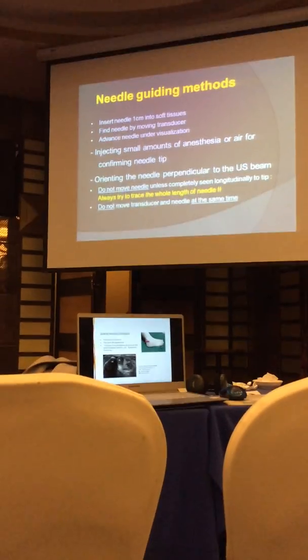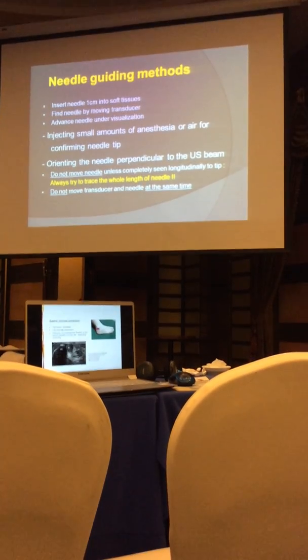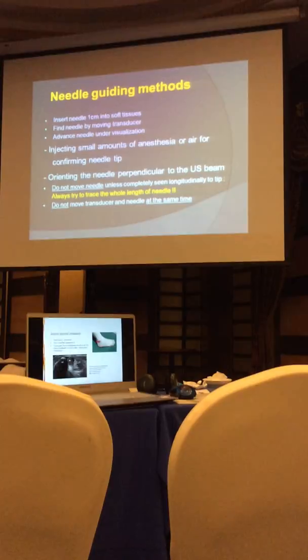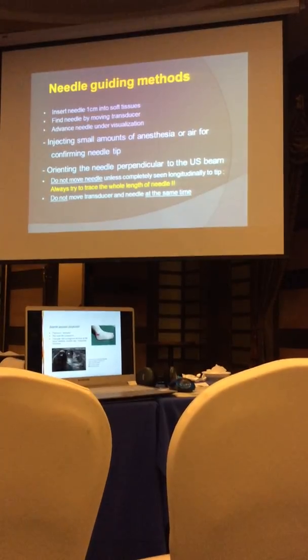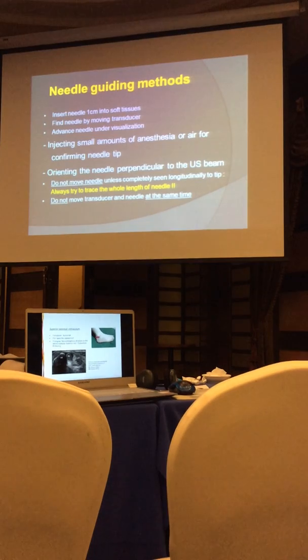Do not move the needle unless it's completely seen longitudinally all the way down to the tip. And always try to trace the whole length of the needle. Do not move the transducer and needle at the same time, as this moves the needle out of view. So make sure you visualize the needle throughout the whole procedure.